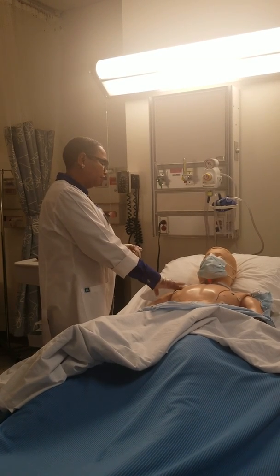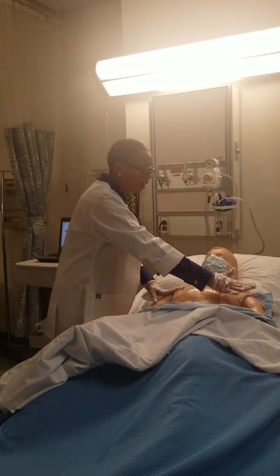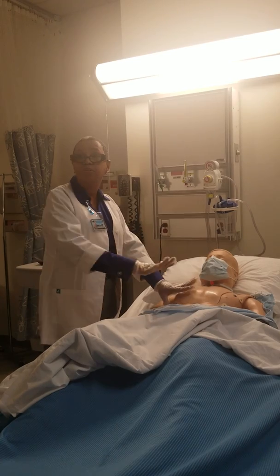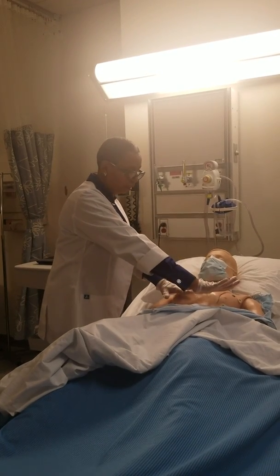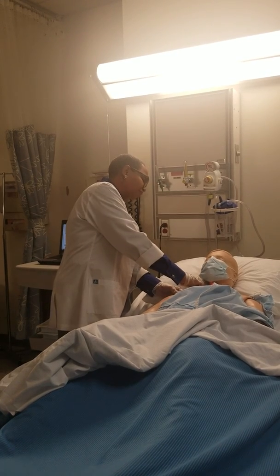So at that point, he's not allergic. I've told him about the procedure. I position him as low as his head will tolerate. If you've got somebody who's exposed, go ahead and put something across their chest so they're not exposed, just to cover them up. Some modesty will do. Then I have to take these dressings off.